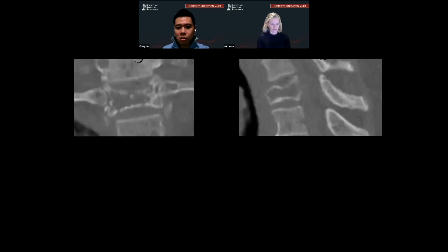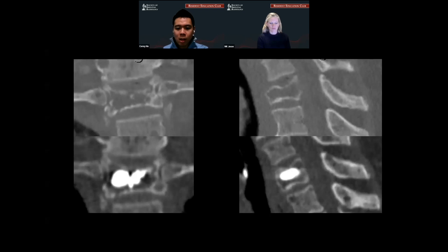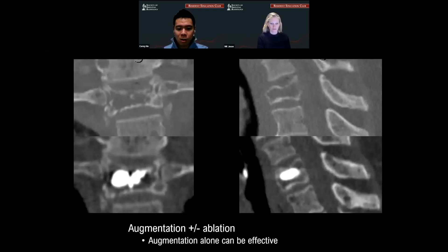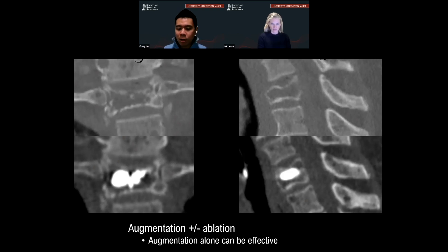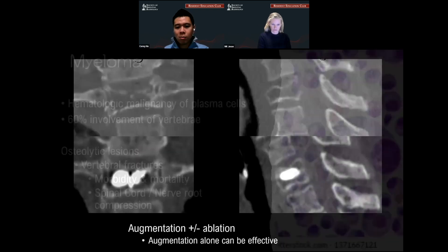Here are the images of the case before, and here are the images after we were able to put some cement in. The trick here — we know it's multiple myeloma — is that augmentation works very well for patients like this. Ablation can also work, but both can be effective. You don't have to ablate is basically the point.